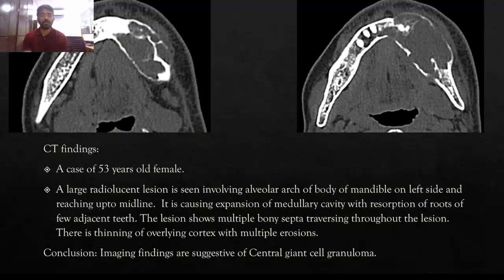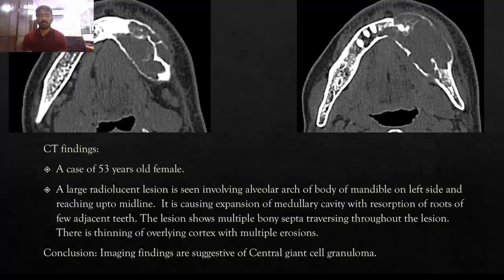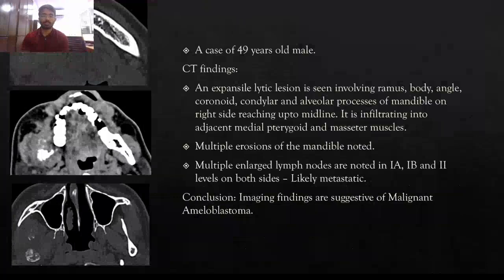Case 5: a 53-year-old female. CT findings show a large lesion in the alveolar arch of the body of the mandible, predominantly on the left side reaching up to midline. There is expansion of the mandibular cavity and resorption of the root of adjacent teeth. The lesion forms multiple bony septa throughout the region, with thinning of cortex and erosion, suggestive of central giant cell granuloma.